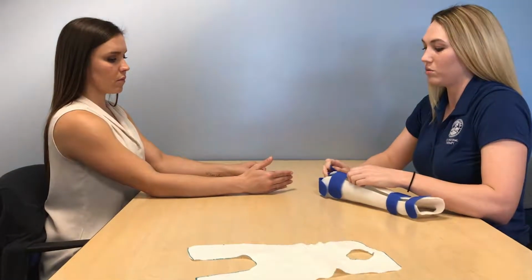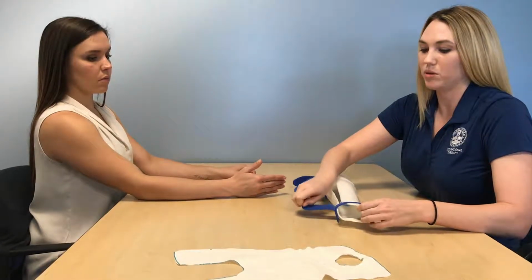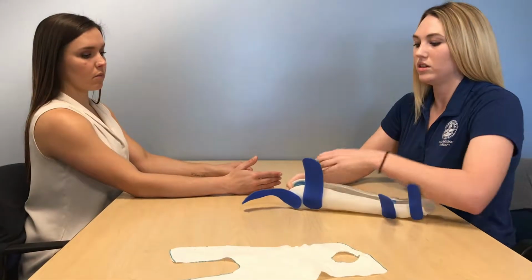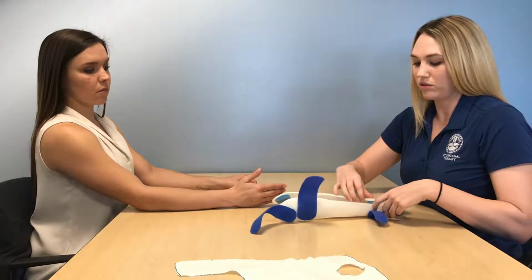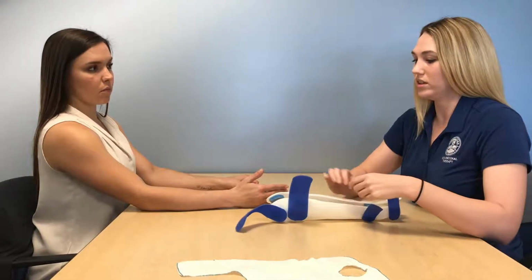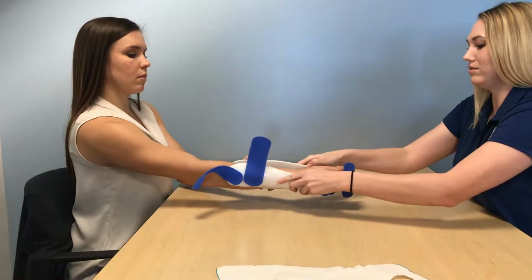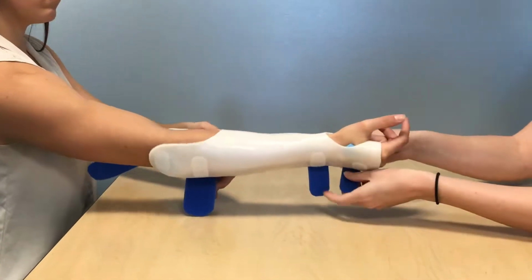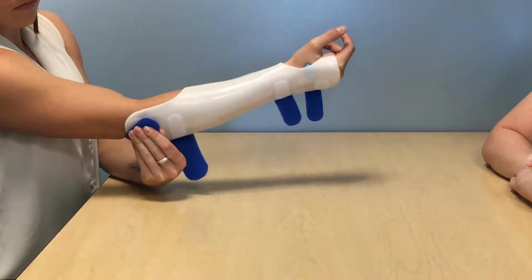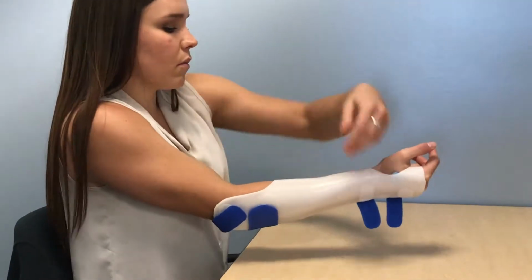Then when making the orthosis, we wanted to also keep in mind her bony prominences to prevent any type of skin breakdown. So we added some padding to the lateral and medial epicondyles, also for the ulnar head and radial styloid. So I'm actually going to have Kylie wear this for us now. And I'm going to have her practice putting it on herself so I can make sure that she can put it on and take it off at home.